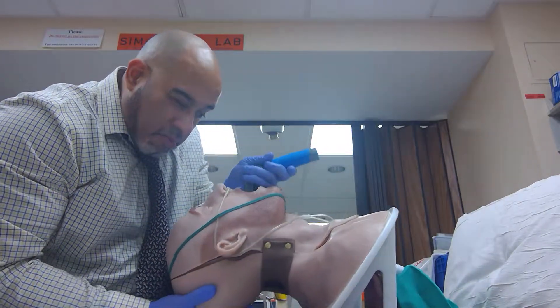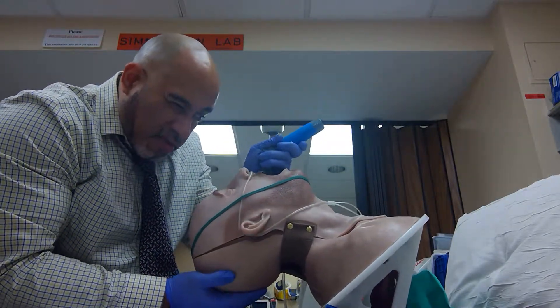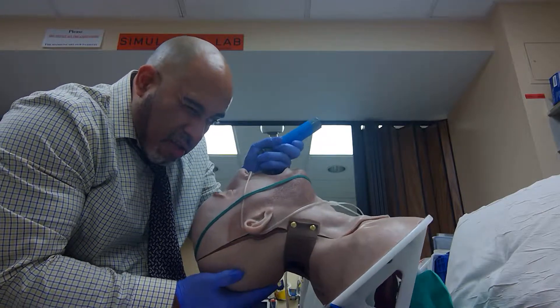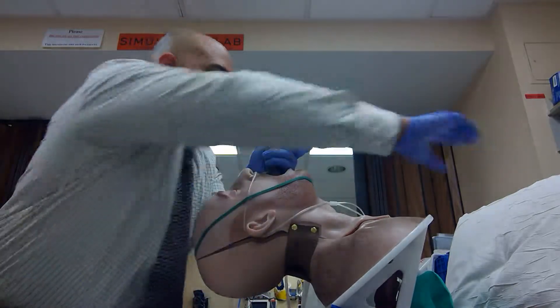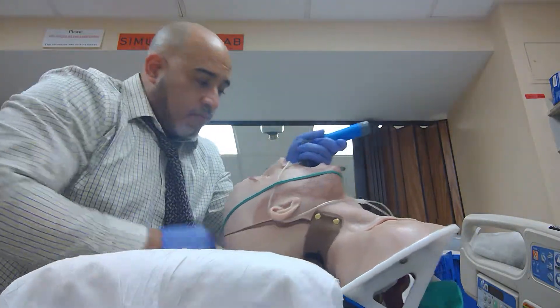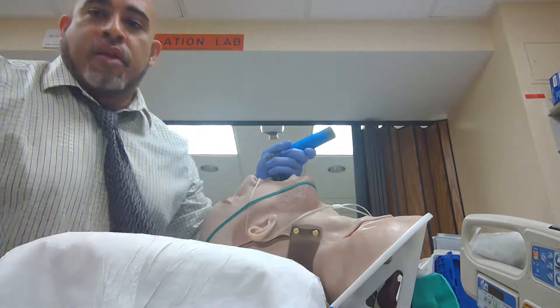Get a better view, align, see the cords. Someone sneaks in the magic pillow or chuck — now I can see my cords and get my ET tube in.